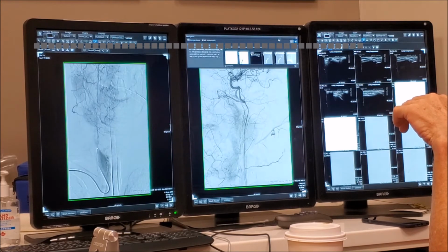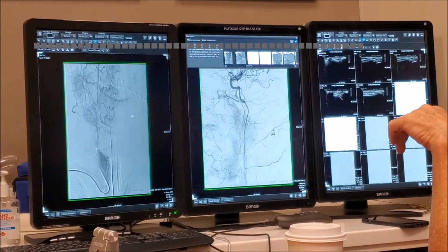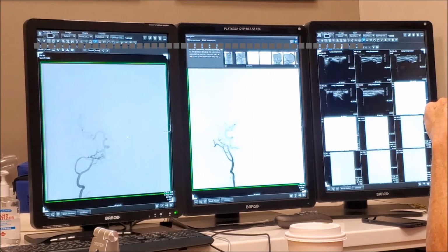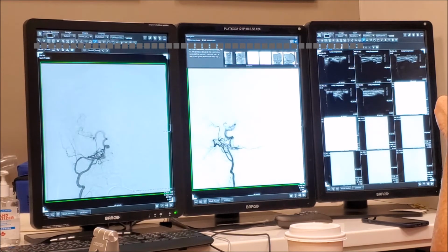Okay, let me see what you did next. This is fascinating. Good, so now we have the head. Good, you did a selective injection of that vessel, so it's a network. Although we selected, what you did in room 3? Room 3, sorry. You can't resolve it. Oh, fascinating. There's the middle. Now, definitely, these are meningeal artery branches, right? Yeah. So we can trace it back.